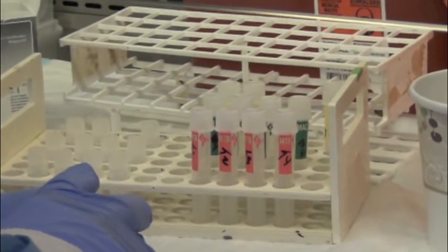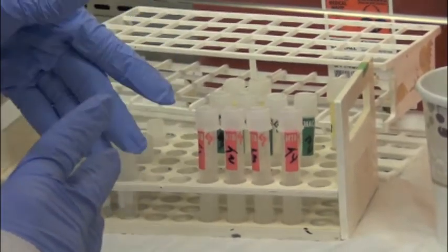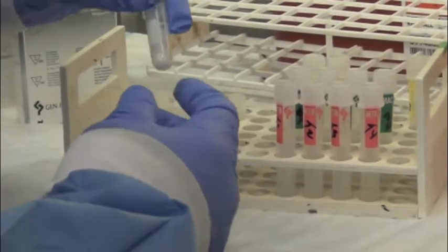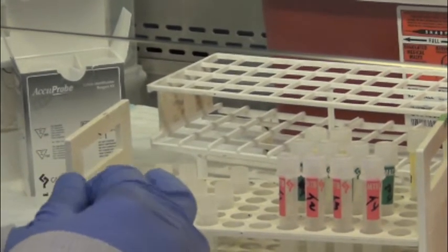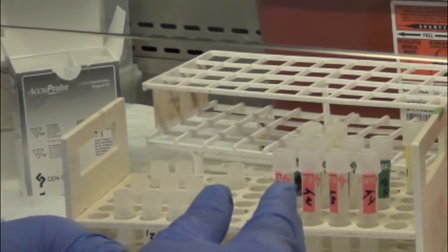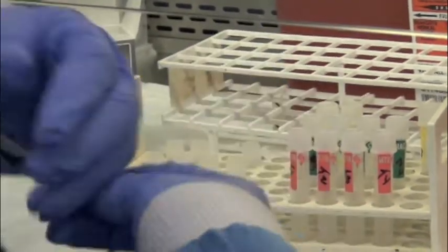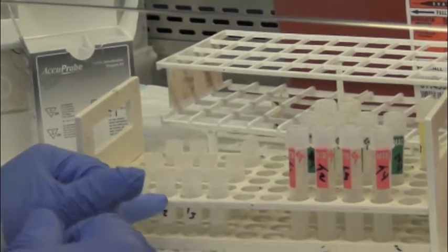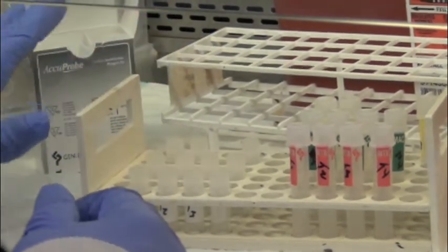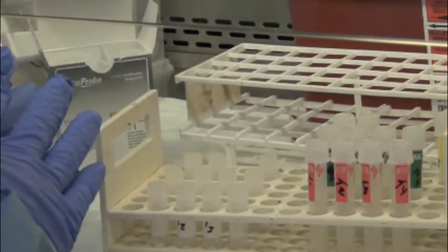Now, what we're going to do is process the patient specimen in these particular tubes here. These are lysis tubes, which have little beads in here, and we'll put some specific buffers in there, and then we'll go through a series of steps where we sonicate first, then heat, and that's going to break up the organism and release the single-stranded ribosomal RNA from these organisms if they happen to be there.